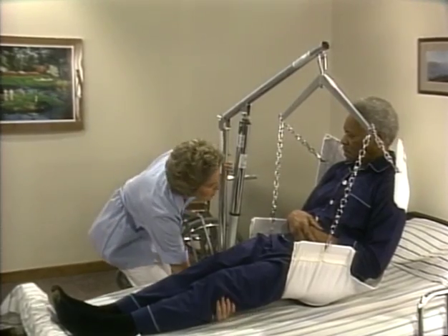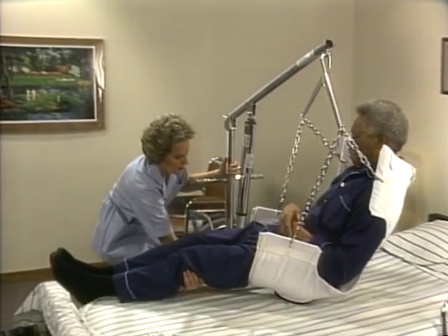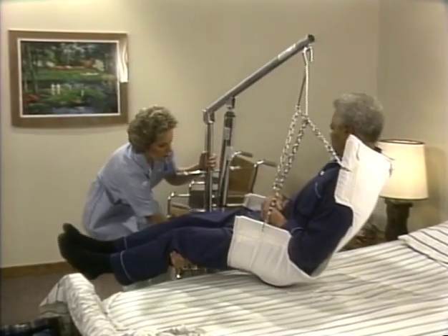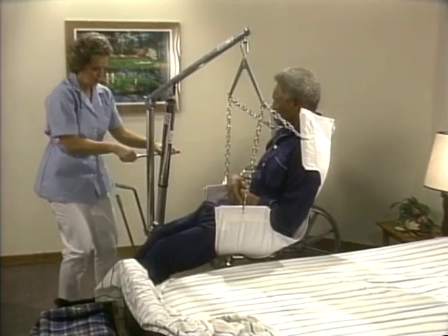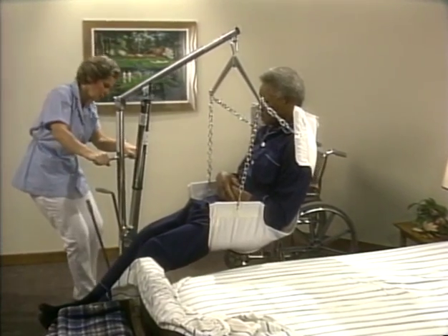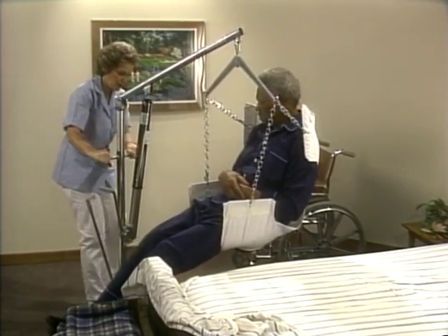When the patient just clears the bed, swing his feet off. Don't raise the patient higher than is needed. Grasp the steering handles and turn the lift toward the chair. Keep the patient centered between the legs of the lift.